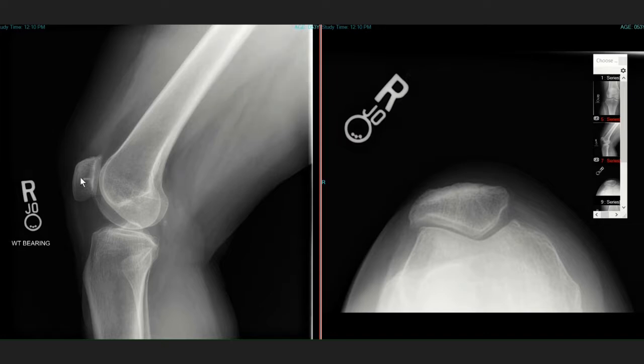So the first assessment that we want to do for patella alta involves making a measurement of the length of the patella itself, which goes from its greatest diagonal distance from the superior pole to the inferior pole, and you'll notice I've cut out just a little distance superiorly to account for the superior patellar osteophyte, and we come up with a measurement here of 39.60 millimeters. 39.60, and I'm recording that here so that we can perform our calculation.